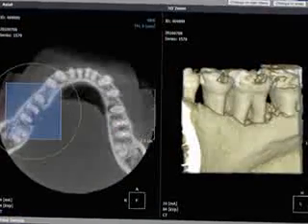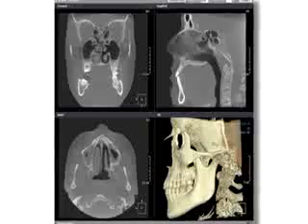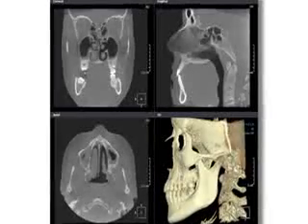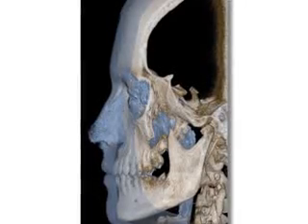And yes, there is some retooling to do, if you want to call it that, because of all the anatomic planes of section: sagittal going side to side, frontal, front to back, and axial going head to toe. There's anatomy that we've never seen before. We've never seen a patient actually in the axial plane of section. So dentists have to really relearn some of their anatomy.